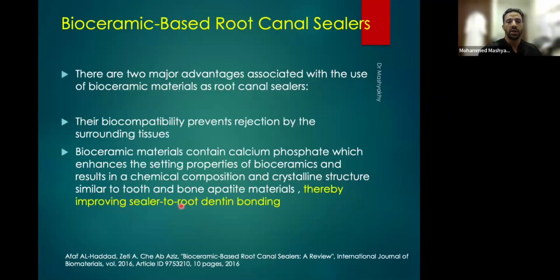There are so many studies about bioceramic-based root canal sealers, which is very important. It's very biocompatible. It doesn't shrink. So one of the important things about sealers is you want a sealer that fits. A sealer is the one that seals the canal, not the gutta percha. The gutta percha is the carrier only. It is the material that fits the sealer around the cone, around the root canal system.